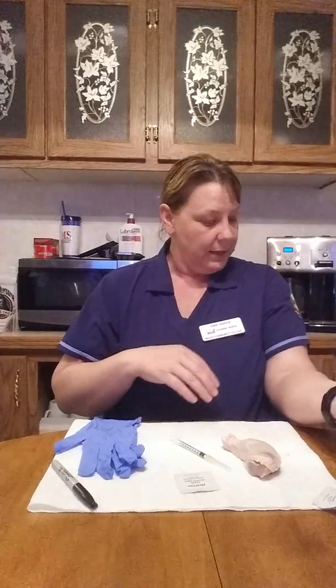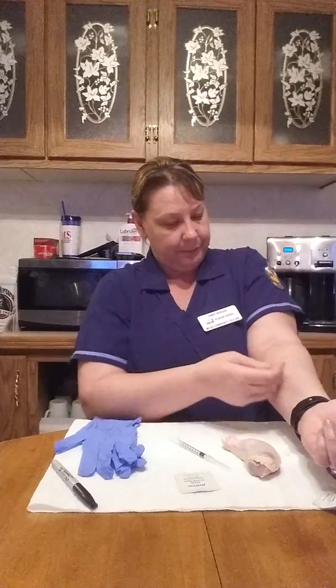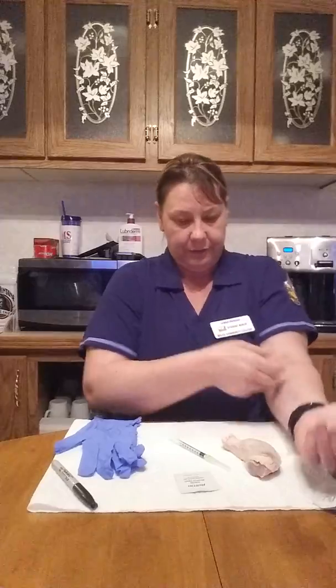So once I get in there, I'm going to verify the patient with two identifiers. So name and date of birth is usually a good way to identify, and explain to them that the physician is ordering a tuberculin test for, usually it's a physical or before, like a safety precaution for work. So once I visit with them a little bit, I'm also going to explain to them that I'm going to give the test about 4 inches below the bend of the elbow, and just right under the skin on the forearm.